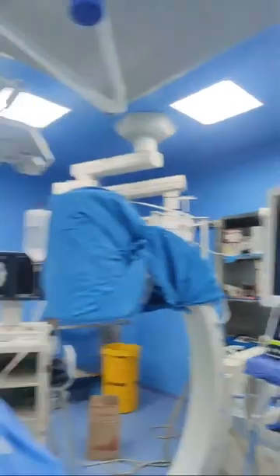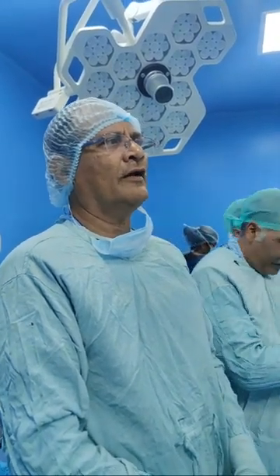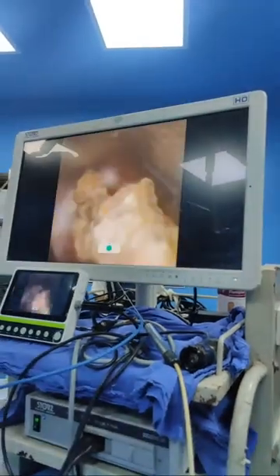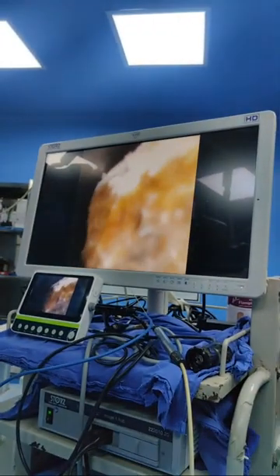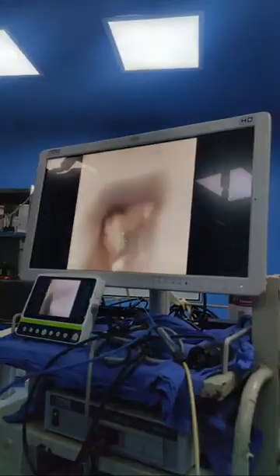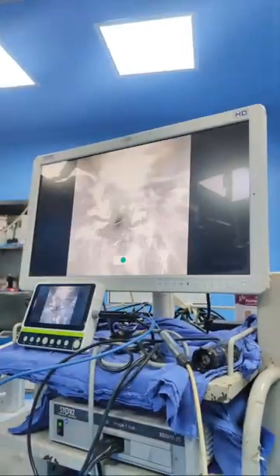Another thing is that in this nephroscope, the probe is always coming at 6 o'clock. So you know where your laser is going, right? Can you see it coming from 6 o'clock position only? If there are multiple fragments, it comes by the side of the nephroscope, and then sometimes you may find it difficult to withdraw. The assistant's job is to see that the scope, the sheath do not come out.